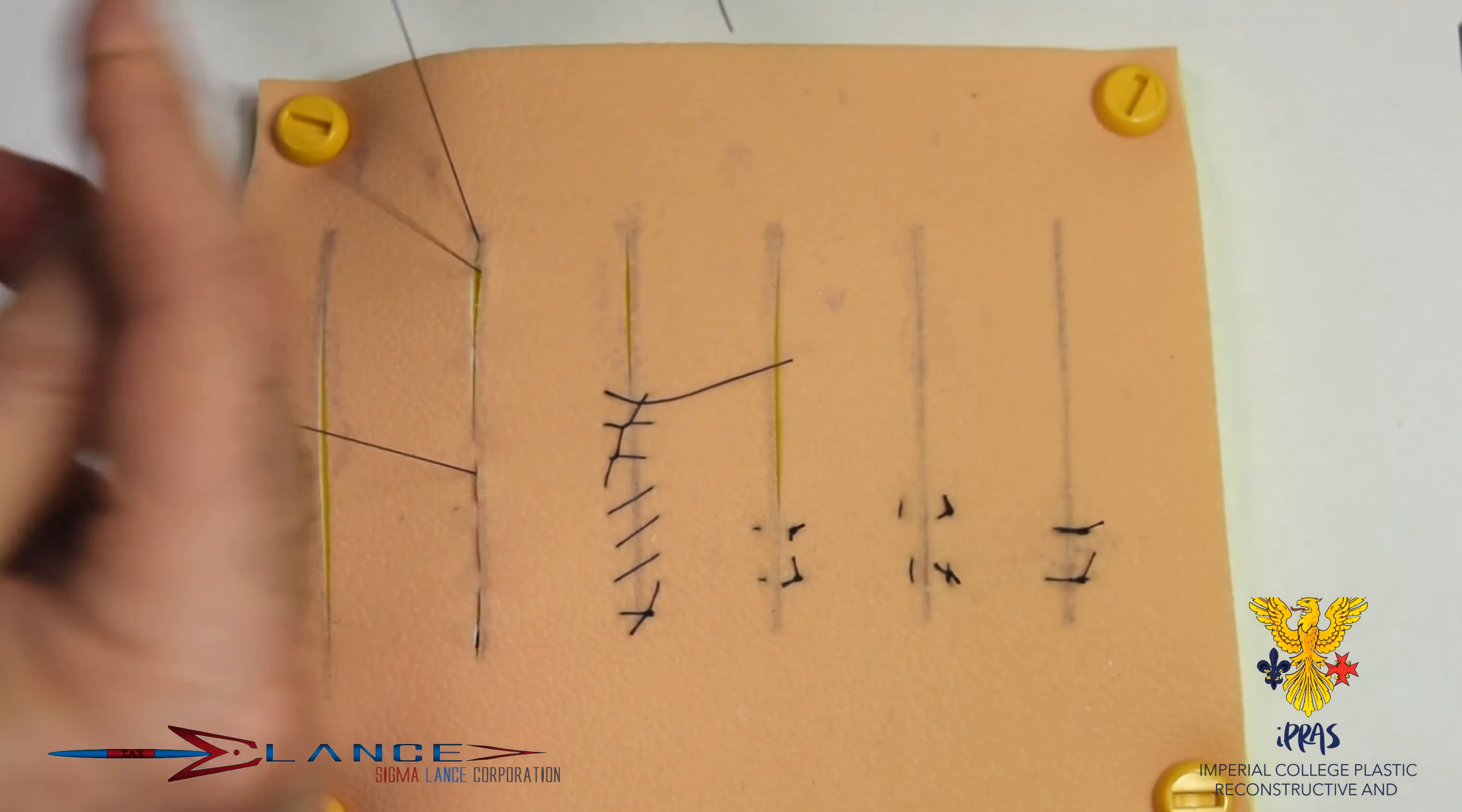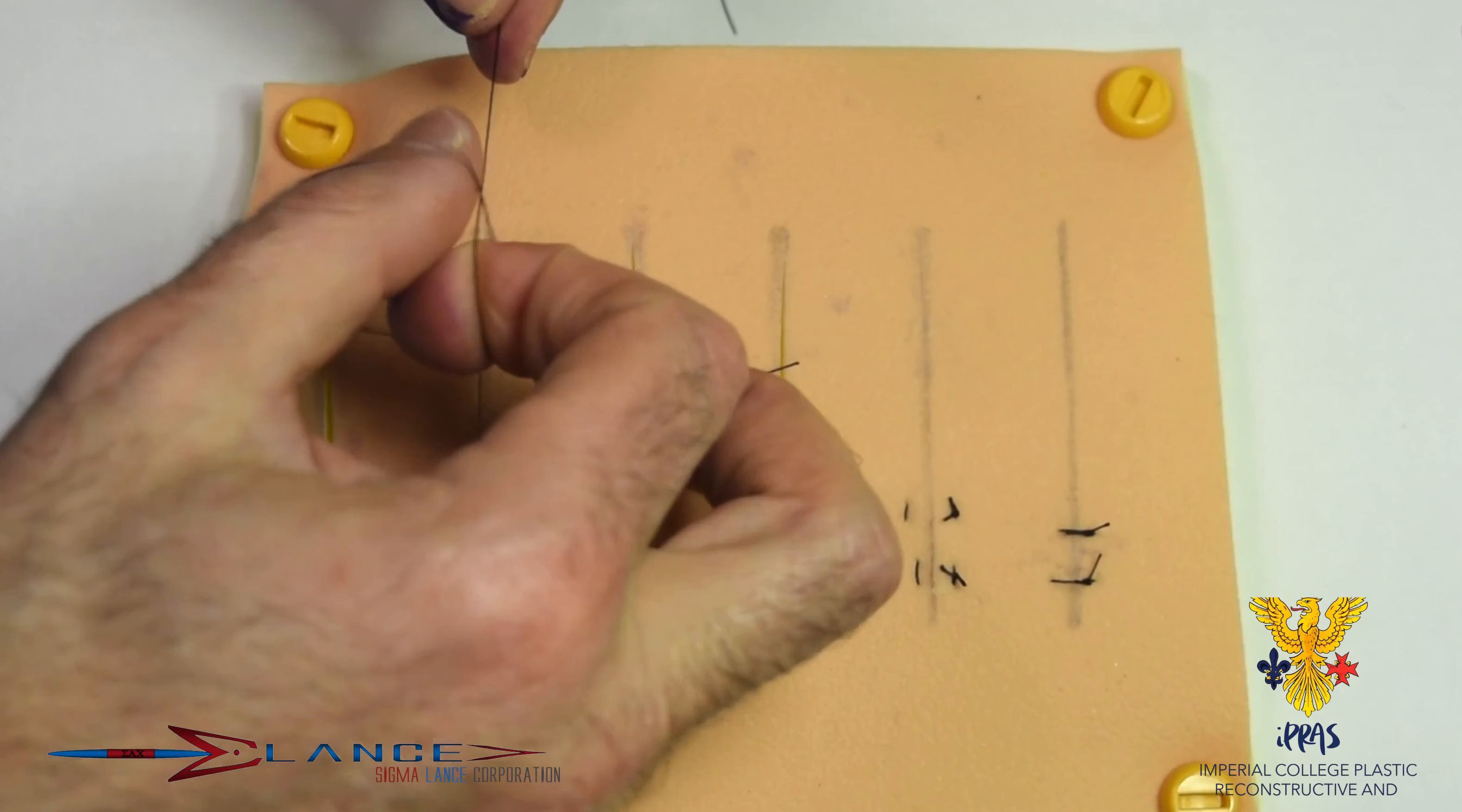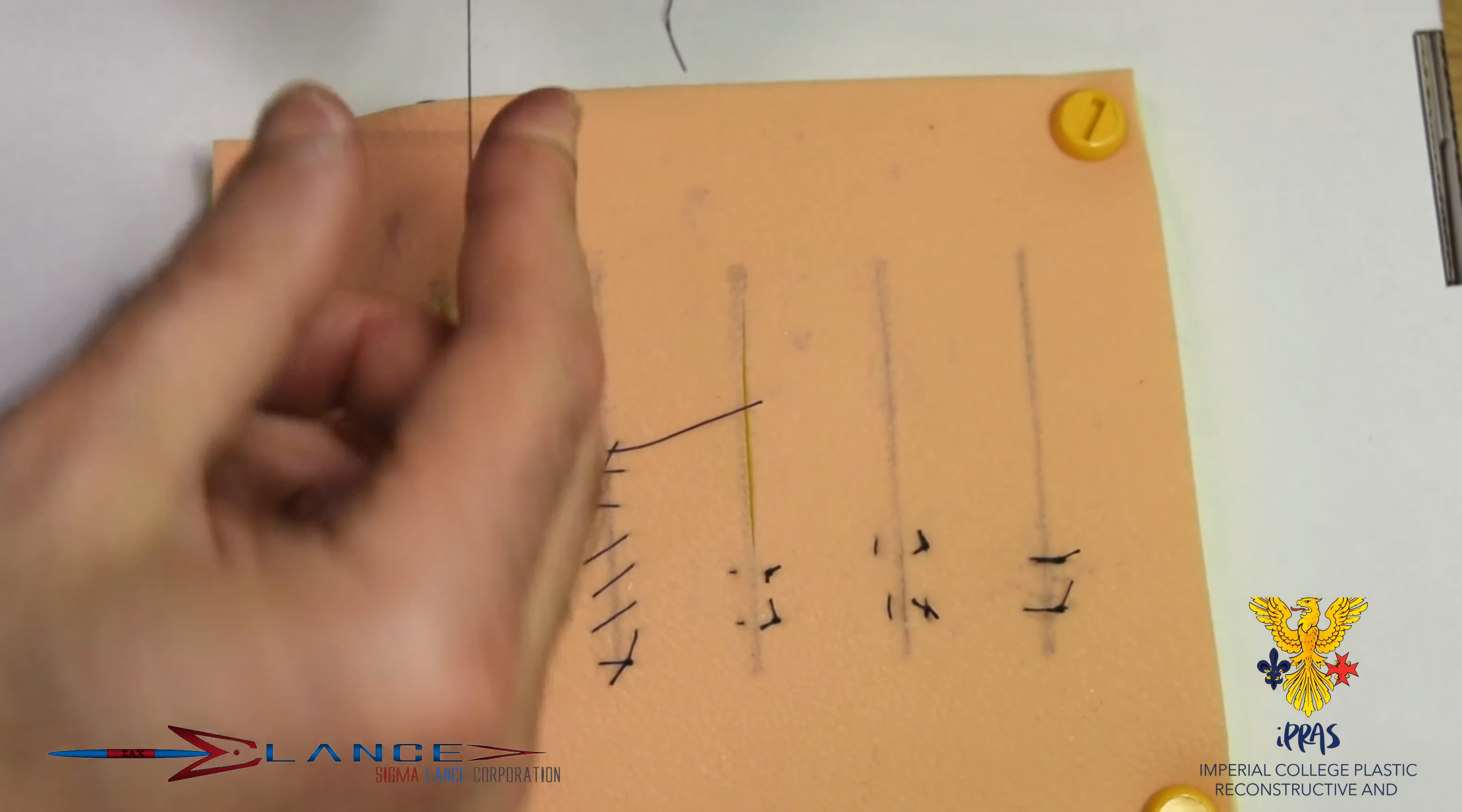And this then usually finishes with what's called an Aberdeen knot. And this may be difficult to demonstrate, but essentially you have to grab the knot between your thumb and forefinger. With your forefinger, you grab the suture and you pull that through. Sorry, that's just torn out, it's difficult to demonstrate.